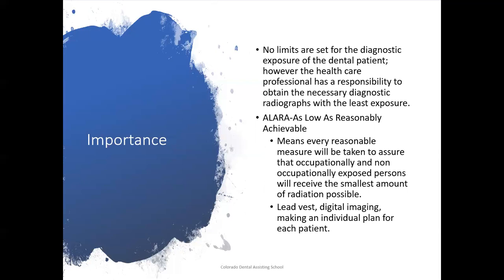So we as dental professionals have to practice what OSHA calls ALARA. ALARA means as low as reasonably achievable. That means we're going to take every reasonable measure to ensure that the occupationally and non-occupationally exposed persons will receive the smallest amount of radiation possible. So what does that mean for you as a dental assistant? That means you cannot be in the room when these films are being exposed.